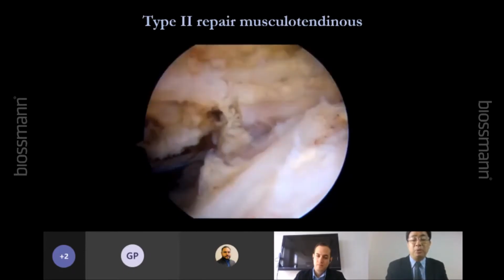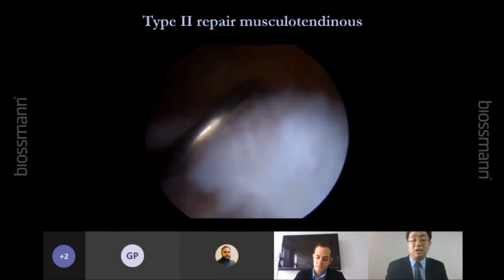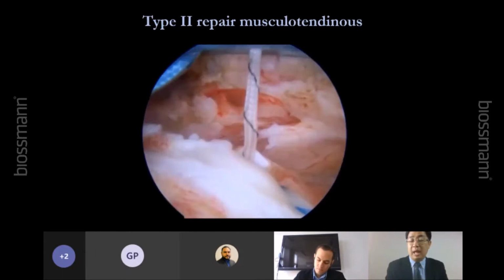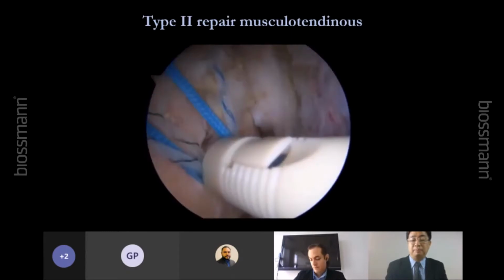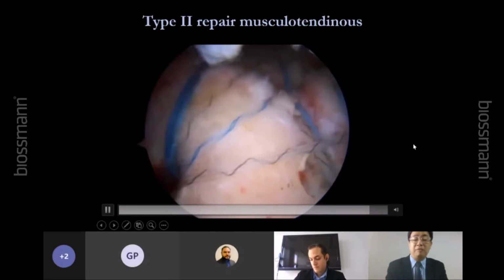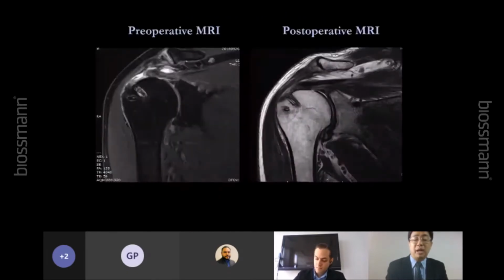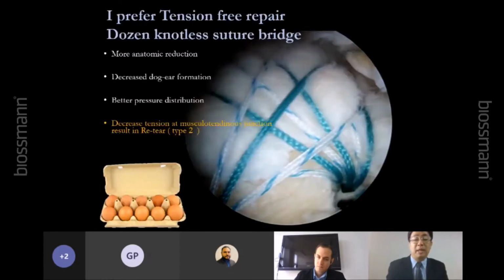So this is the way we do it. We call it the musculotendinous repair, like the tension band technique. We didn't tie the knot, okay? And we pass the suture from the proximal to the footprint, right? So this is our technique, the musculotendinous repair. And we found that the patient had a good result and the cuff healed nicely after the revision. So we reported the technique of the musculotendinous tear repair, using the lateral row anchor to avoid cut through. You can read my article in Arthroscopy Techniques.